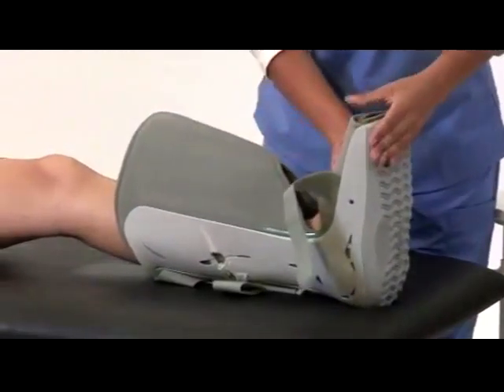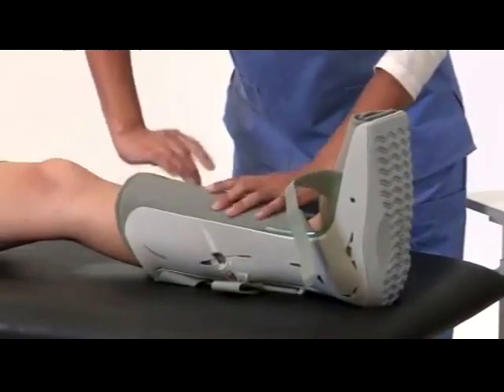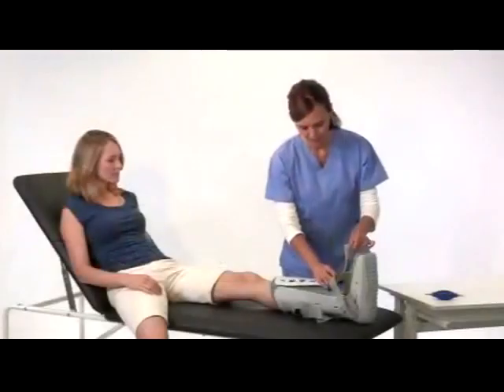Next, wrap the liner around your foot and leg. Smooth the wrinkles and secure. Finally, replace the front panel and secure the straps from bottom to top. Tighten them so they are snug and comfortable.